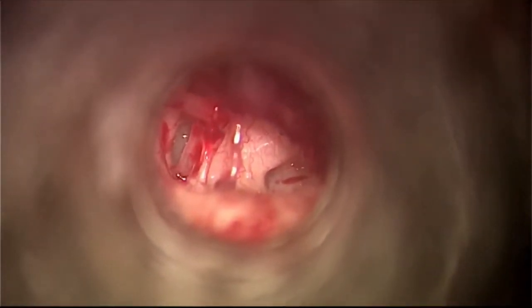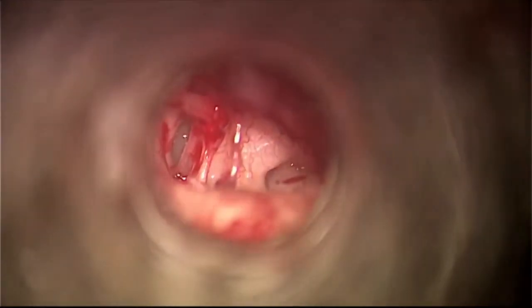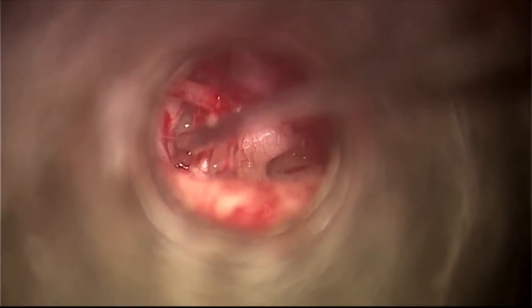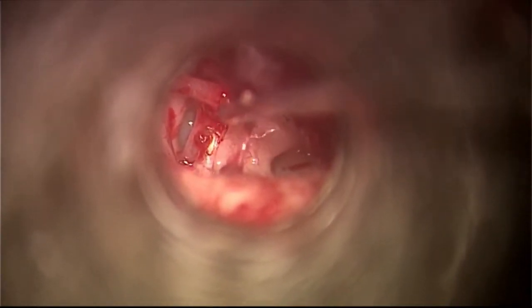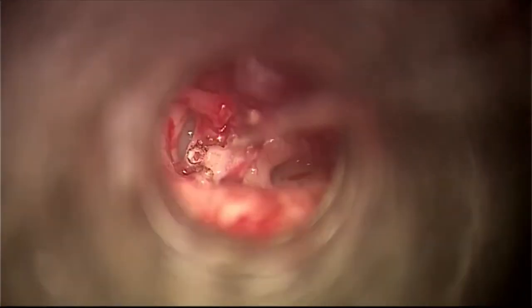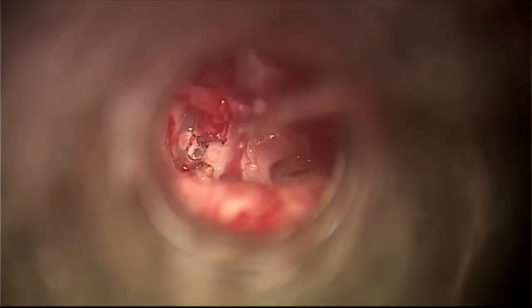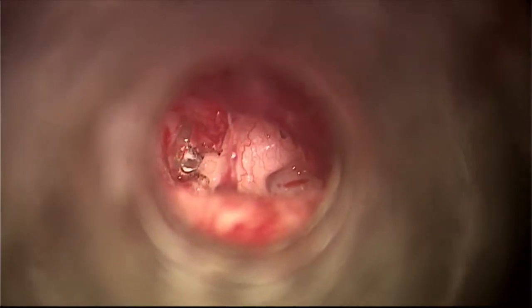Now see my laser beam. Yes. On the tendon, it is just for rehearsal, I told you. The tendon is just for rehearsal, to check that my beam is in alignment. That's it. Gone. Now the posterior crus. See that? Yes. See, it is weakened. Can you see? Yes. Right. Hollowed out.